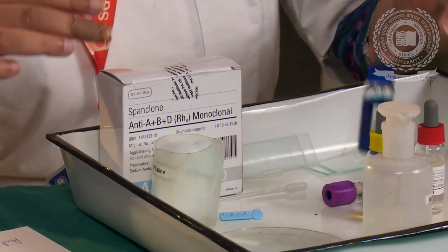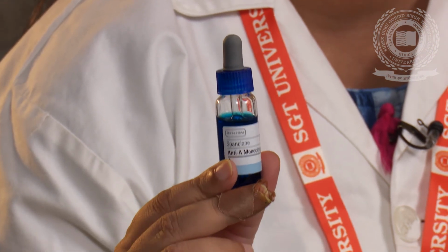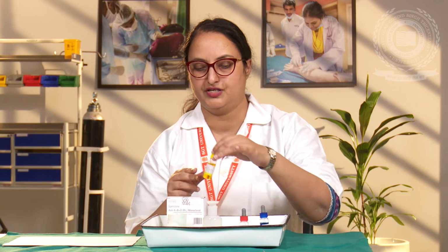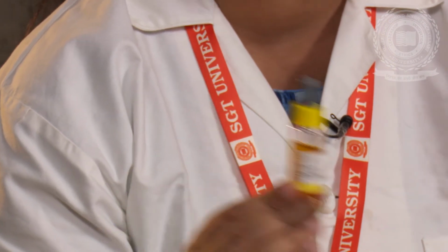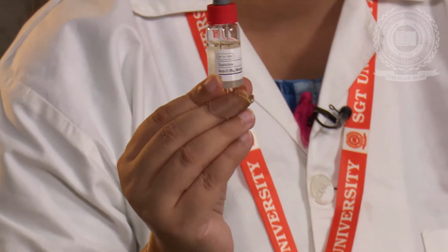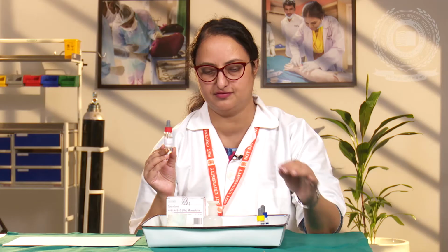Inside it, this blue bottle contains anti-serum A. It has artificially prepared antibodies against the A antigen. The yellow bottle is anti-serum B. It has artificially prepared antibodies against the B antigen. And the colorless is anti-serum RH. It has artificially prepared antibodies against the RH antigen.